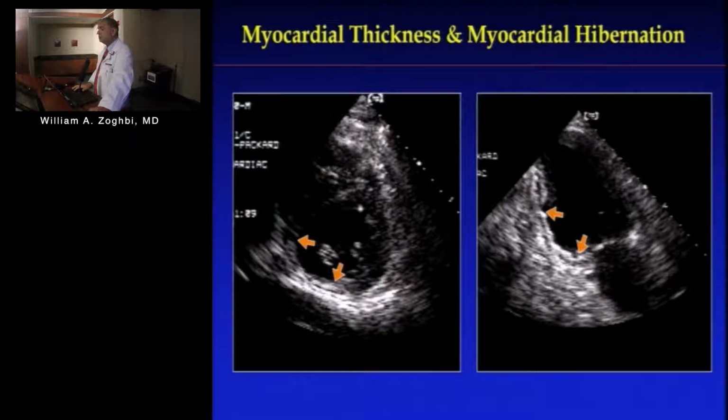Another thing that you could use, believe it or not, is thickness of the myocardium. And I know Dr. Shah had a beautiful presentation that although overall it works well, there are some situations where it may not work well. But let's go through that.